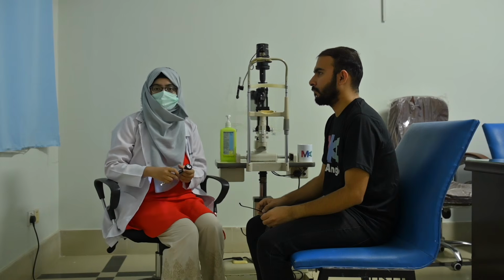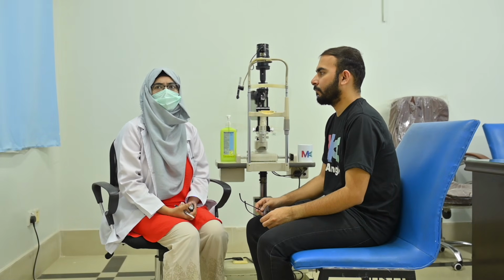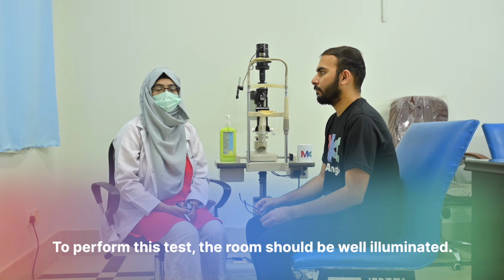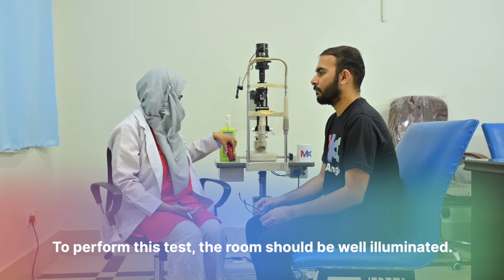The next step is near reflex test. For that purpose, the room should be properly illuminated. The light should be illuminated.